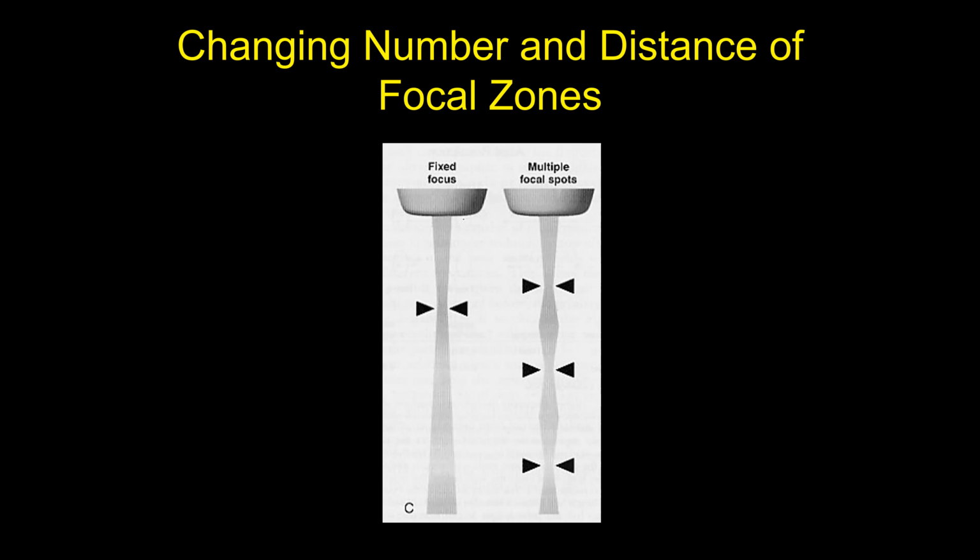They found ways that they can electronically make the beam form a narrow diameter so it keeps it from diverging as it goes deeper and deeper into the soft tissues. And that's called focus. And on most of these ultrasound machines, you can electronically adjust the focus of the beam to a particular depth in the body, where you can maintain good resolution even at a deeper depth. Okay.